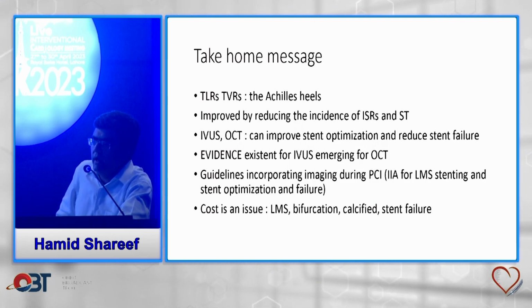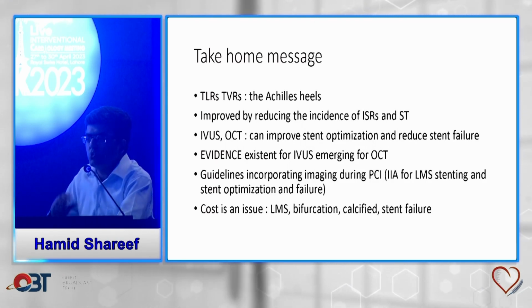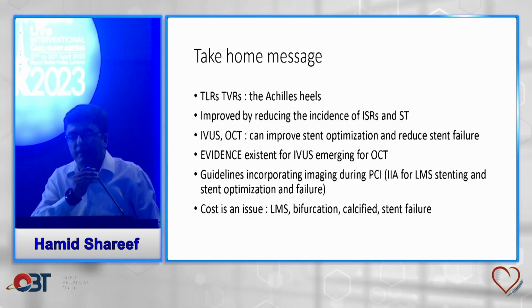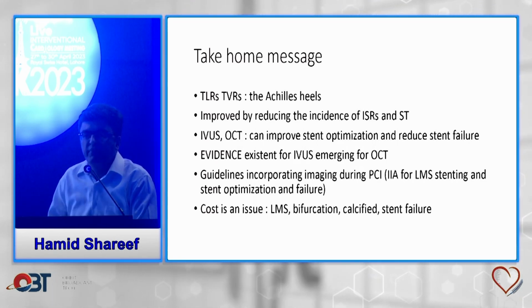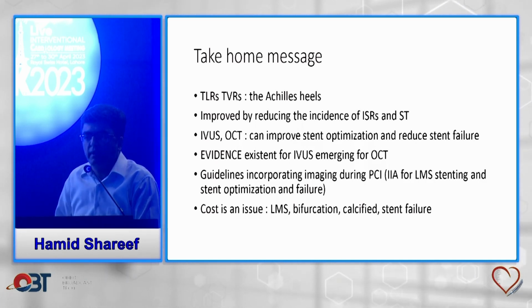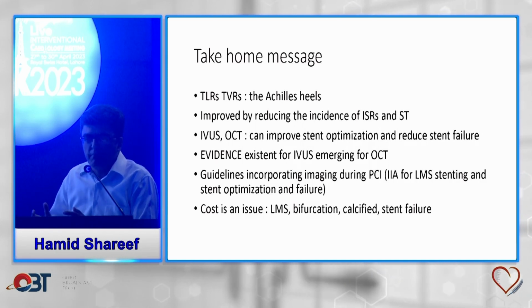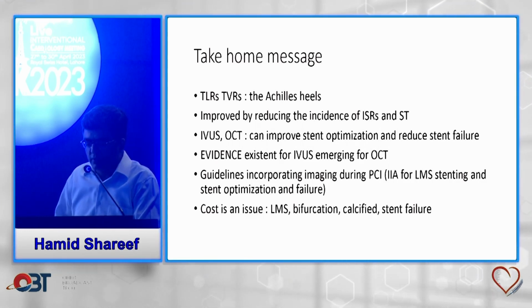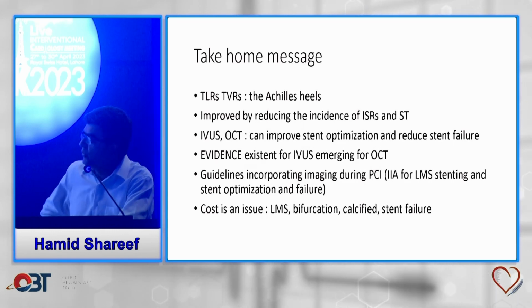Cost is an issue. In our part of the world, cost is definitely an issue, so we must consider IVUS or OCT in certain cases when the stakes are quite high. Those patients who have left main bifurcation lesions, who have complex lesions like Medina 1-1-1 LAD diagonal lesions, complex lesions, CTOs, diffuse calcific lesions. In all these patients, we can use IVUS. This can improve the outcomes.